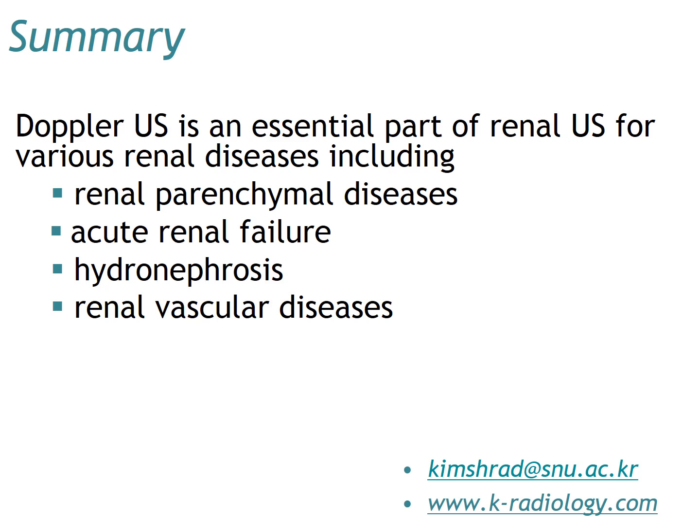In summary, I would say that we may use Doppler ultrasound as an essential part of renal ultrasound for various renal diseases, including renal parenchymal diseases, acute renal failure, hydronephrosis, and renal vascular diseases.